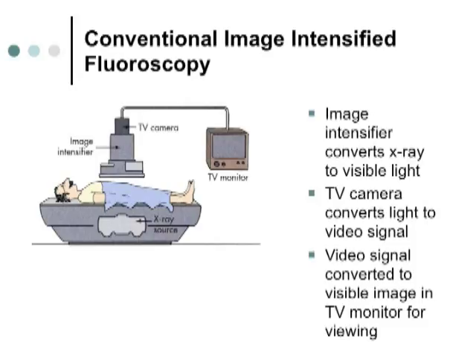But in a fluoroscopic room, if it's a dedicated unit or a stationary fluoroscopic room, the X-ray tube is actually located underneath the table base. The table base is lead lined, therefore there's no scattered radiation to the operator other than the radiation coming off of the patient. So we're not worried about X-ray coming out of the X-ray tube, hitting the table base, and then bouncing out, that sort of thing. So this is really a nice setup if you're in a stationary unit.